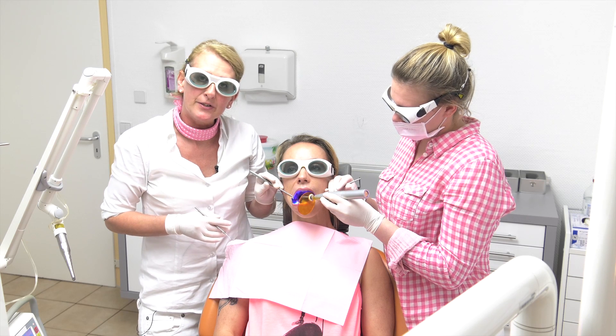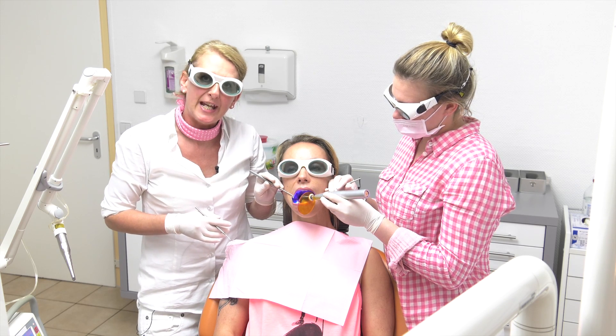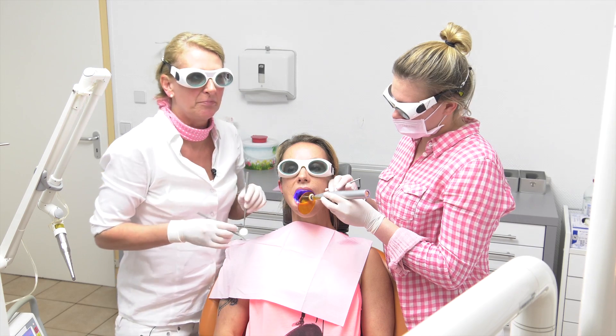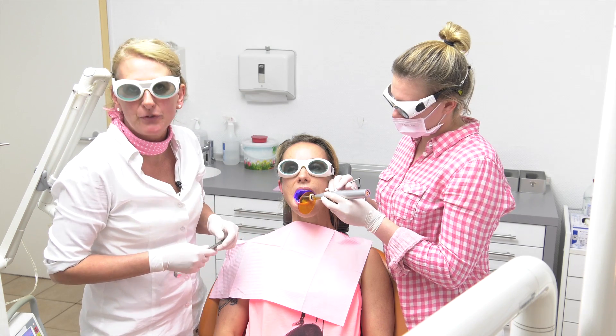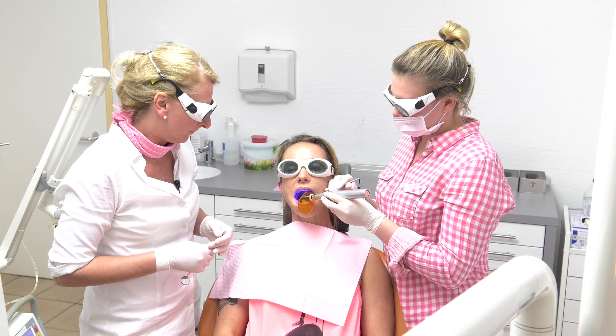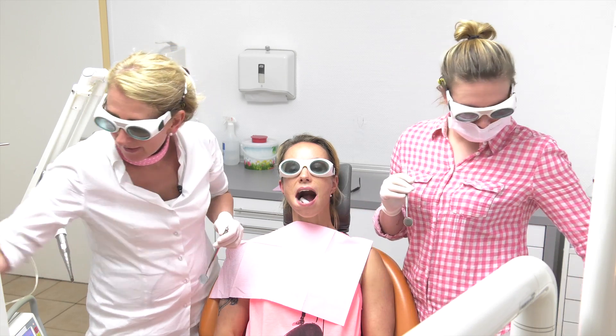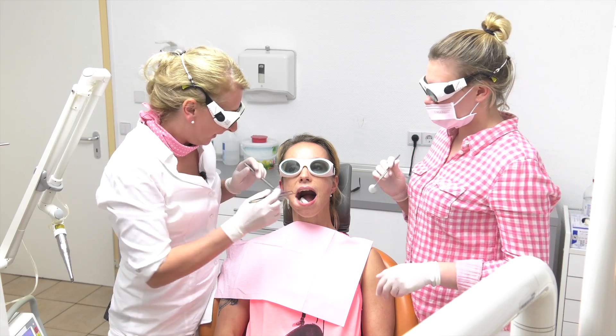You could see it — it's a very fast treatment. Normally when you use the etching, it needs about 5 to 10 minutes. Afterwards I take off the cotton.